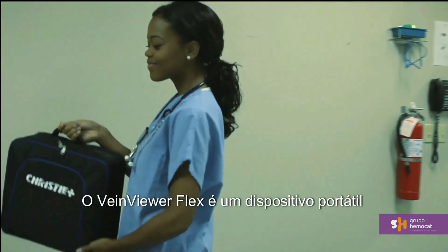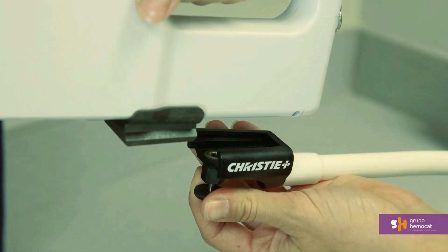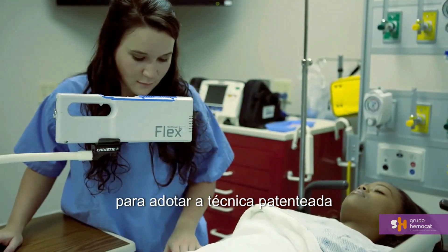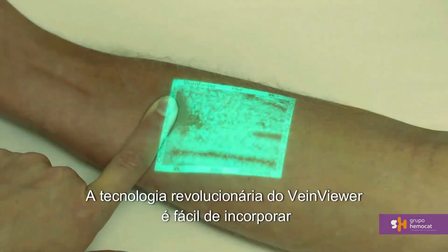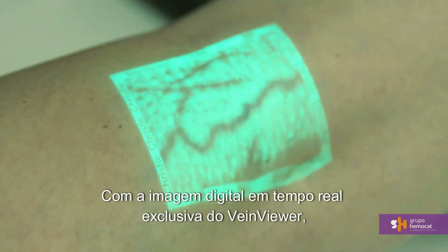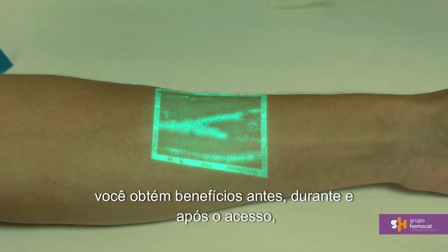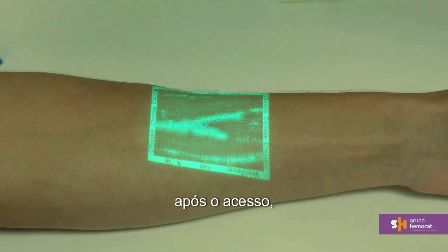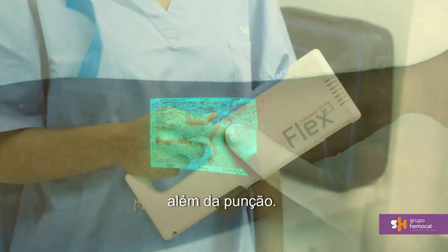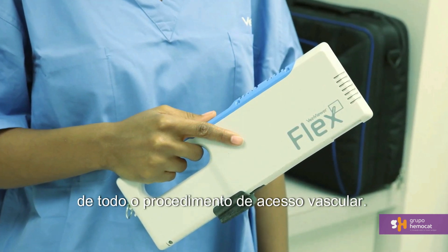VeinViewer Flex is a handheld device that allows you high mobility for rapid assessment. It is recommended that during the venipuncture procedure, you dock Flex in the S-mount or stability mount to achieve the trademarked eyes-on-patient, hands-free technique. Flex's revolutionary technology is easy to incorporate into your venipuncture procedures. With VeinViewer's unique real-time digital image called AVEN — Active Vascular Imaging Navigation — it provides pre-, during-, and post-access benefits that may help you improve the success of the entire procedure beyond the needle stick.